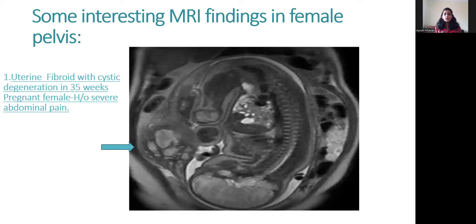Some interesting cases of MRI findings in female pelvis. First case: uterine fibroid with cystic degeneration in a 35-weeks pregnant female with history of severe abdominal pain. On MRI, this is the fetus and this is the anterior wall intramural fibroid with cystic degeneration.